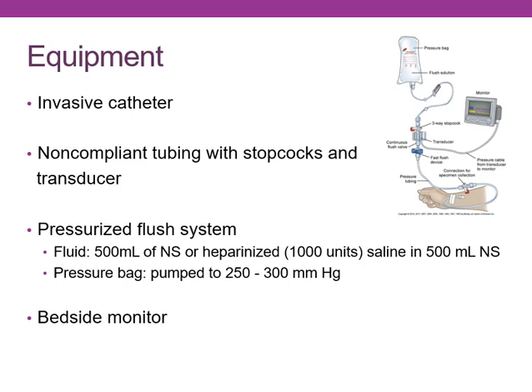So what do we need? We need the invasive catheter. We certainly need a consent for this. That's up to the healthcare provider. I need what's called non-compliant tubing. Everybody around calls it pressure tubing, but the real name is non-compliant. The test name is non-compliant tubing. On that non-compliant tubing, it does have stopcocks and a transducer. The transducer is this little piece here that takes what's going on in the patient and changes it over to a waveform that I can see on the monitor.